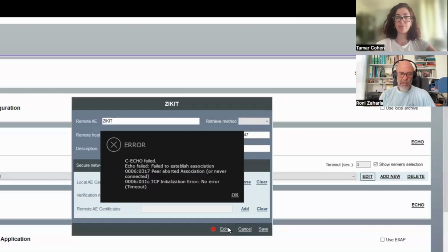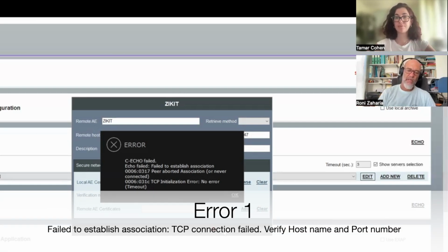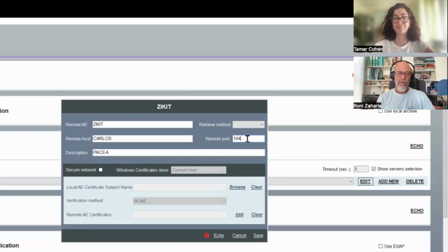Okay, so you get here "peer aborted association" or "never connected." It means that we tried to connect to the server and there's nobody listening, or we just didn't get it. This is the most common error, and you need to check your parameters, the host name and the port number.